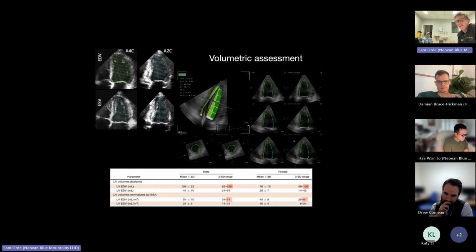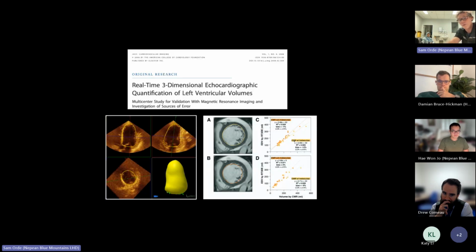Okay, so the next thing that we're starting to get on more and more of the machines, and certainly it's talked about in the cardiology literature, is 3D analysis. Echo machines are getting better and better, and 3D transthoracic probes are getting better and better. Indeed, I think on GE now, some of the new probes can all do 3D analysis, whether you've got that package or not. So the imaging is enticing. The images are beautiful. If you talk to any rep in any company, they'll show you that 3D probe and their image panel, and it looks absolutely incredible. Hence it's made it into guidelines. And the reason they're trying to sell it is not just because it looks pretty, but because it's also shown to have high degrees of correlation, better than 2D imaging for ejection fraction, versus MRI as the reference standard. Incredible graphs are drawn showing how accurate it is.